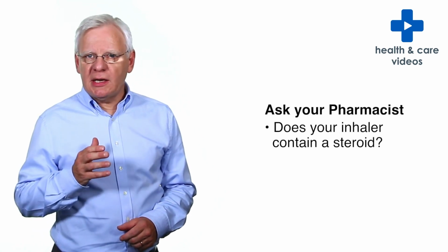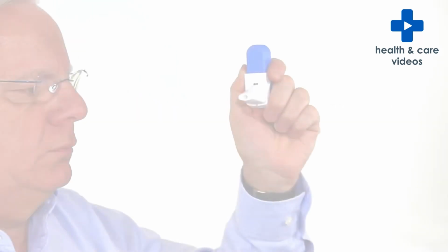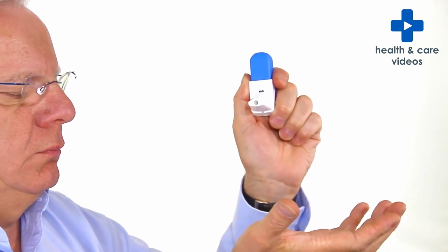If you accidentally click the Easyhaler at any time, click it more than once or breathe into the mouthpiece, you need to empty the powder by tapping the mouthpiece on a table or the palm of your hand.